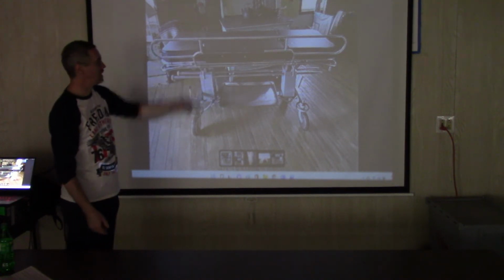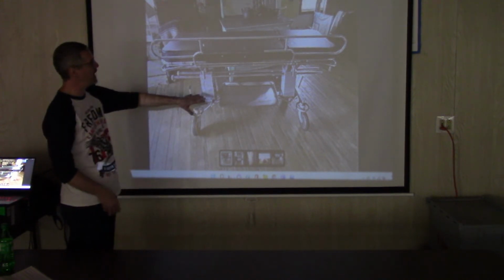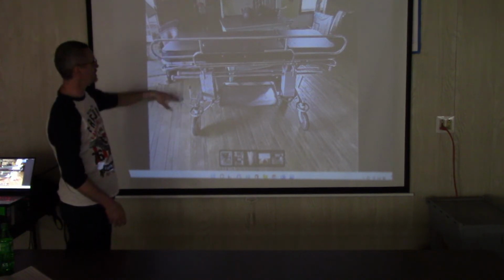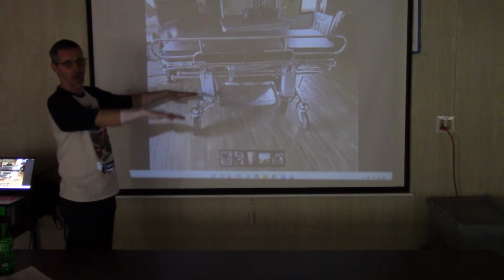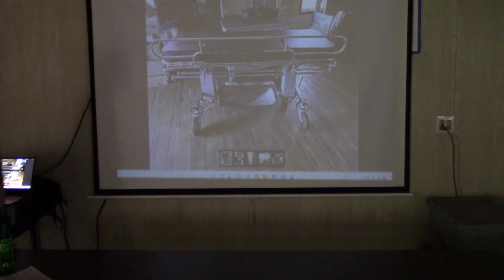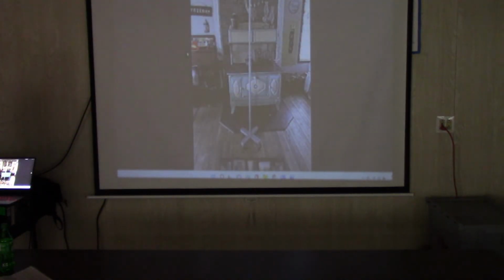It's got a storage tray underneath. We're probably going to have a tote with some items that stay with the bed. The head end does tilt up on it, and it's got the foot jack, so you can raise and lower the bed, and you can independently tip. Like if you need to elevate the feet, you can tip the whole bed up to do that. We were looking to get a cot for the infirmary. Came across that, said, well, we're getting the surgical gurney. That's it. Yep. That's what we're having.